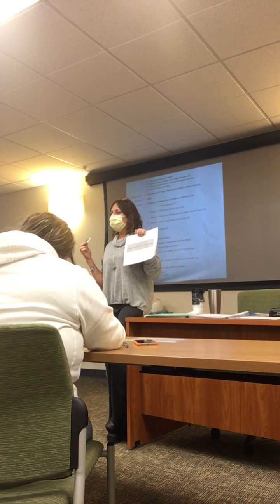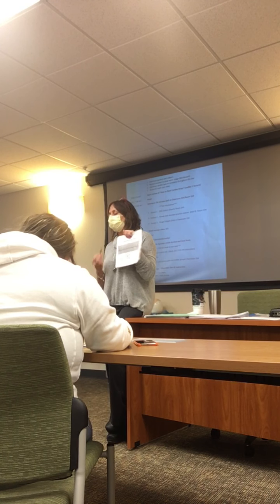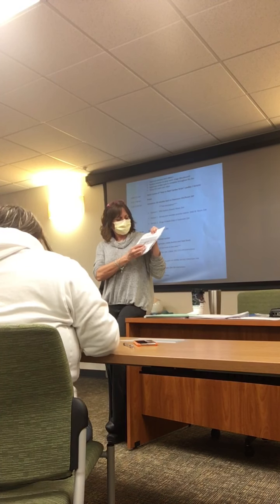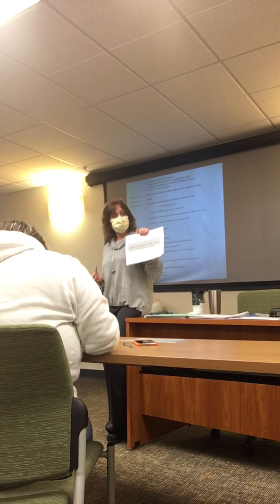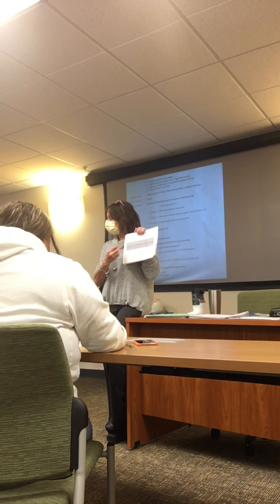How do I tell if the atrial rate is regular? What part of this EKG tracing tells me what's going on in the atria? The P wave. P waves. So I can take my calipers and measure P wave to P wave. And what am I finding here? Is that a regular rhythm? Yeah. Is everybody okay with that?